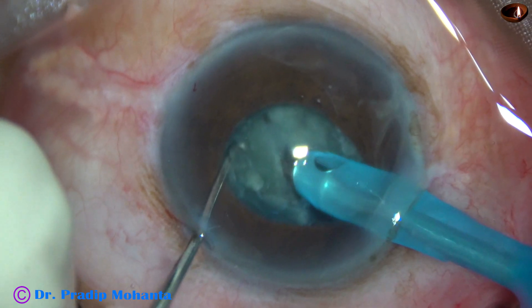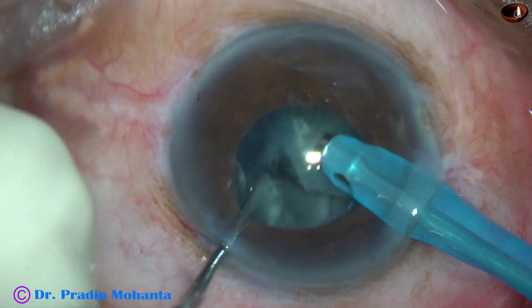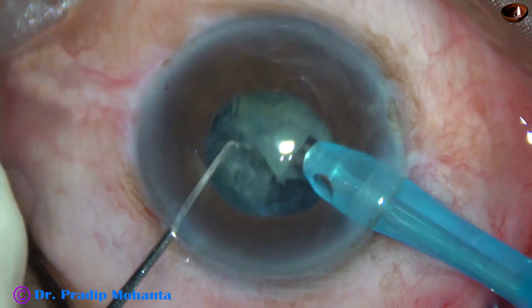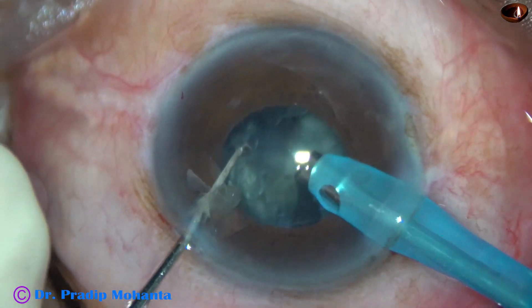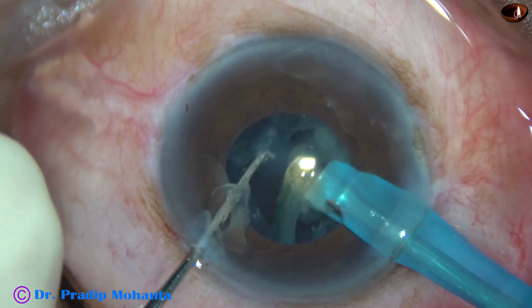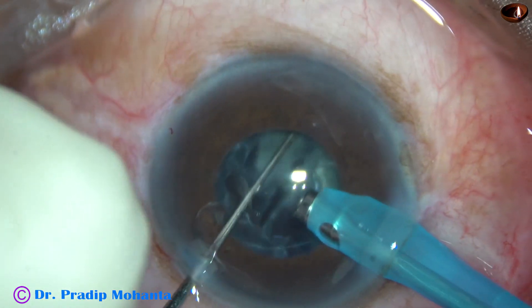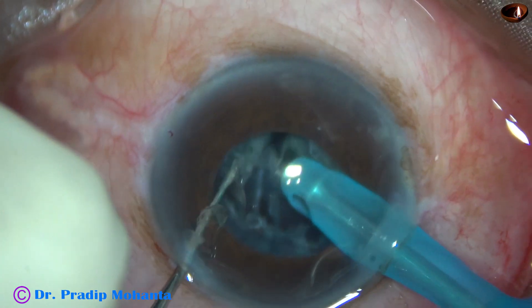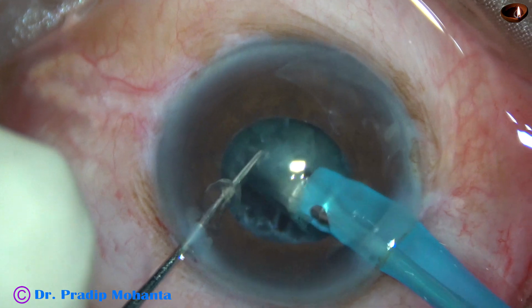Now I hold the left hemi-nucleus and chop it into two pieces. Each nuclear piece is emulsified with ultrasonic energy — it is hit and off. This is the other piece; I have isolated the other hemi-nucleus here. It has got two pieces. I am trying to pull out one piece, and I could do that.